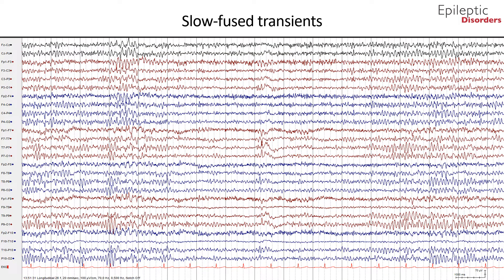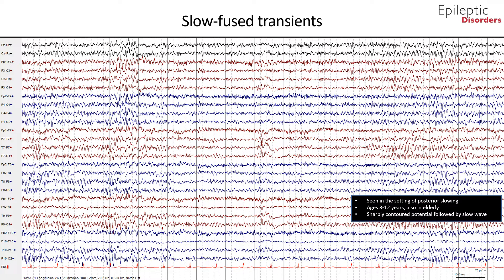In this bipolar montage EEG, we will go over slow fused transients. Slow fused transients are often seen in the setting of posterior slowing, in preschool-age EEGs (ages 3 to 5 years) and in older children (ages 6 to 12). These slow waves are often preceded by a sharply contoured potential that blends together with the ensuing slow wave, giving the appearance of slow fused transients. These are important to recognize as they are commonly confused with spike-and-wave activity. Slow fused transients are also seen in elderly subjects where the non-epileptiform sharp transient is fused with the temporal slow of the elderly.